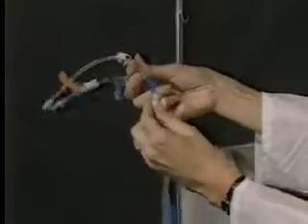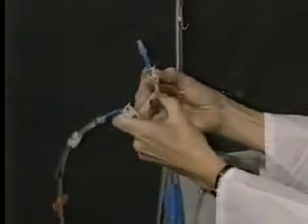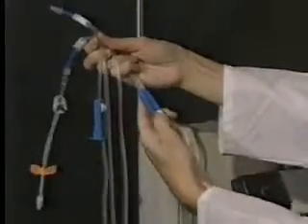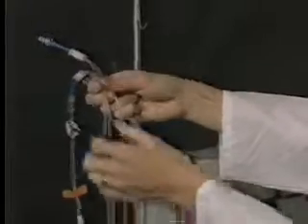Close the white pinch clamps on the access and return lines. Next, locate the access and return saline lines and close the roller clamps on these lines as well. Press the Continue key, and the system instructs you to connect the fluid containers.